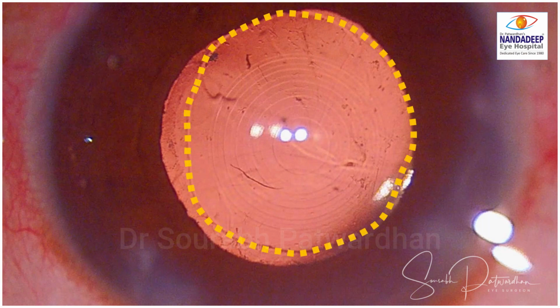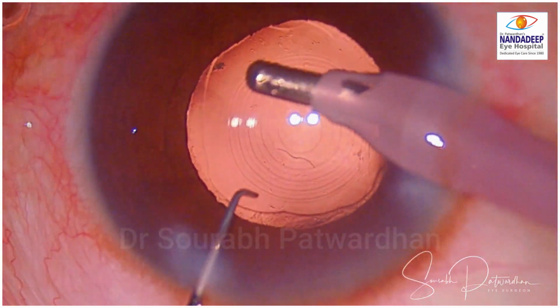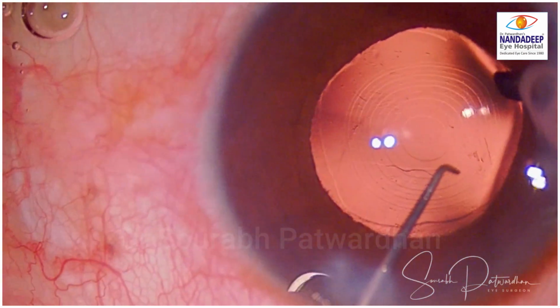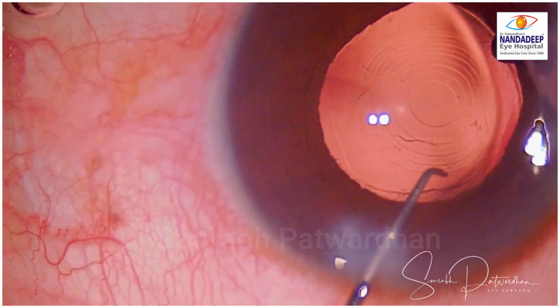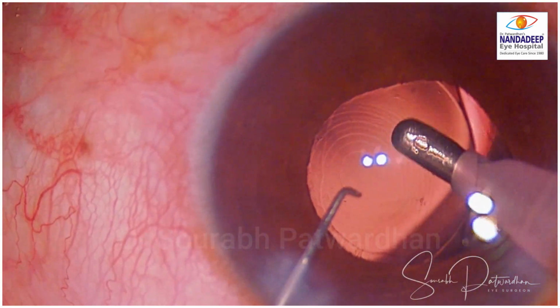So until you are sure that both the haptics are in the bag, don't close the case. Now you can see that the IOL is well centered and both the haptics are in the bag. So it is going to give me a great refractive outcome.